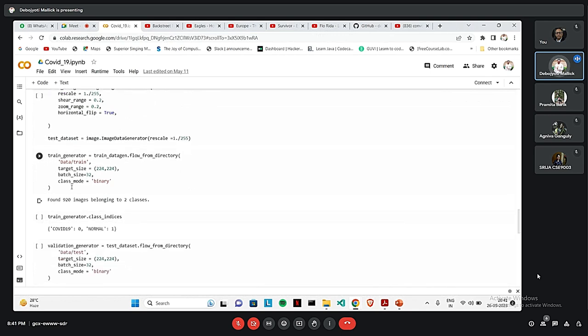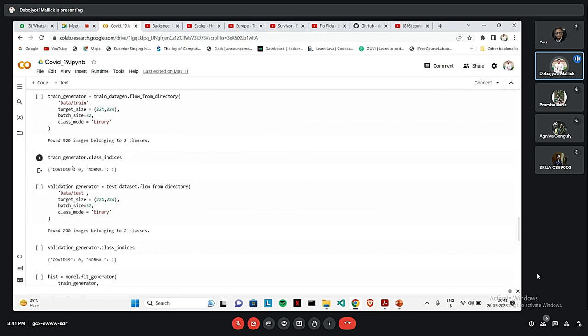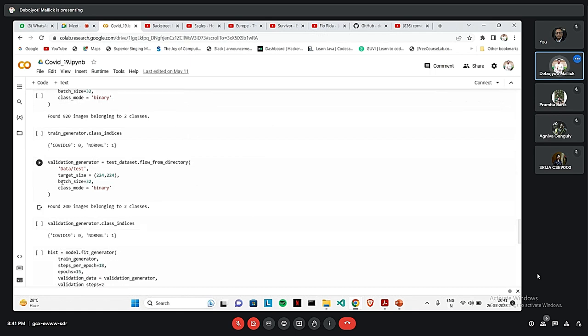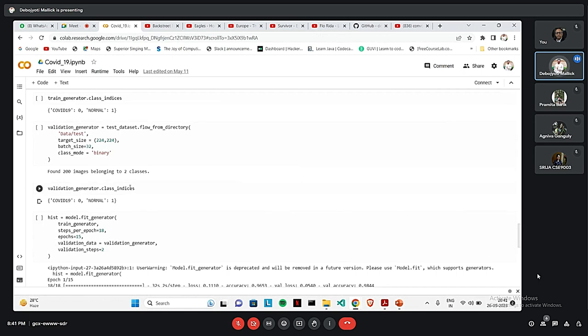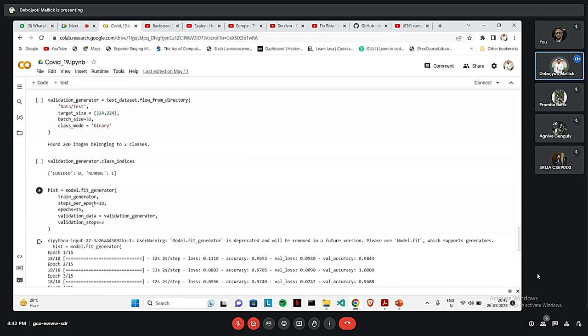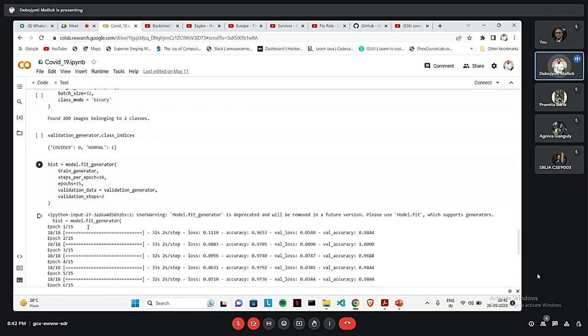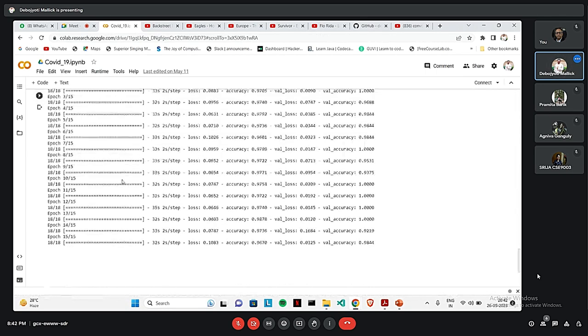Train generator function, class mode will be binary. So, 920 images have been found belonging to two classes. Then we have used train generator for class indices. Train generator function given the class indices, COVID will be 0, normal will be 1. Then, validation generator, again the same thing. For that test data set, we have found 200 images belonging to two classes. Again, the class indices will be COVID as 0, and normal as 1. Lastly, we have used the model fit generator to actually train the model.